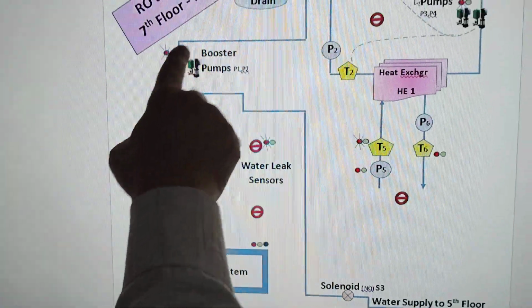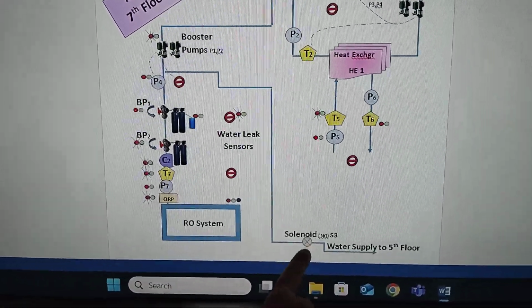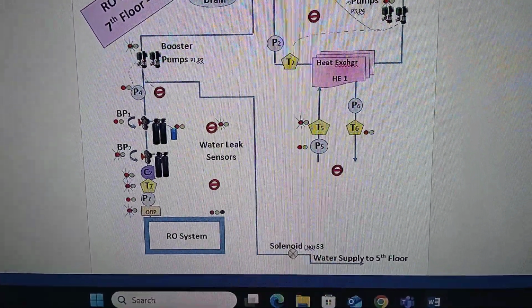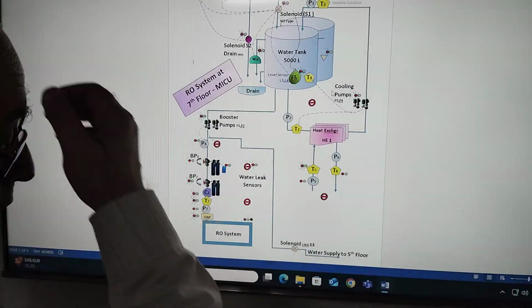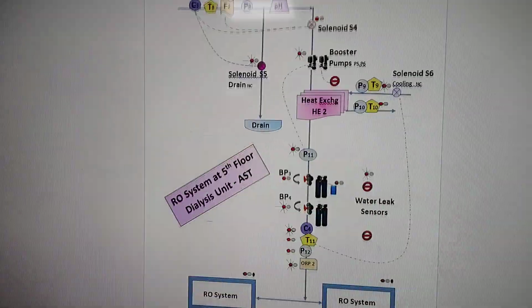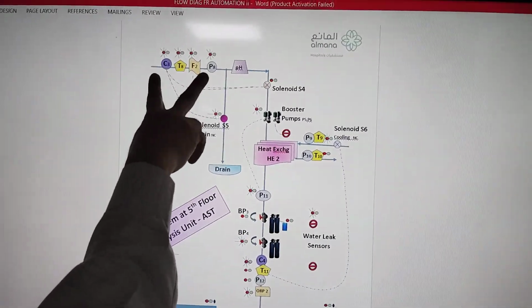And another line from after the booster pump will go to the 5th floor, down into the dialysis unit, where it is connected through a solenoid S3. In case of any problem or something like that, this can be shut off, and then the water supply can be cut off to the 5th floor. If there is any leakage or any problem over there in the 5th floor, it can go down. Then the water comes into the 5th floor through the same sensors.